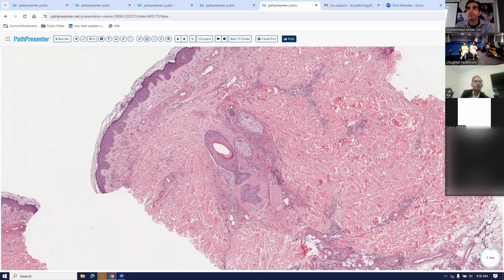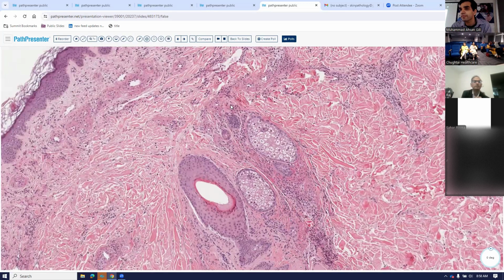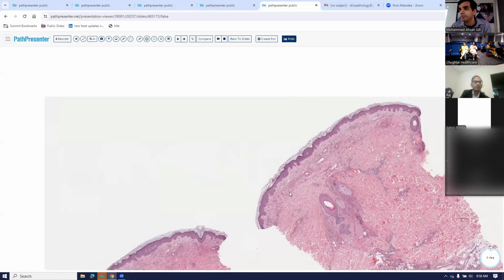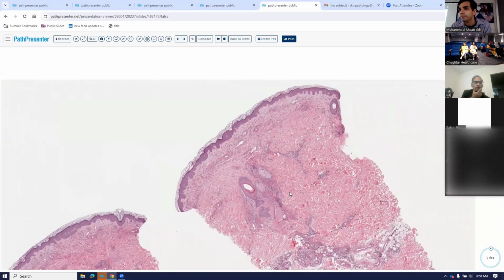So now this is another very classic case that you are definitely going to see in your practice. So let's go a little bit back, low power. And all these slides are shared with you. So please go back and look at them, and try to think about what I said. Then you start getting a better sense of all the things that we talked about.